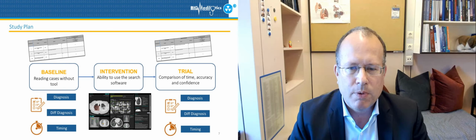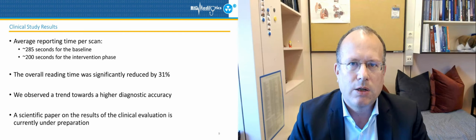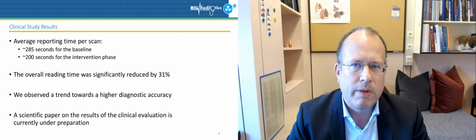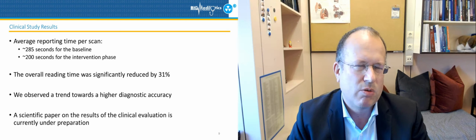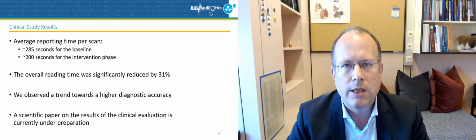So the interesting point was, and I did not personally expect this, that the reading time decreased. We don't look for information on the cases, because we are trained radiologists, so in many cases we don't even look for additional information in textbooks or on the internet.